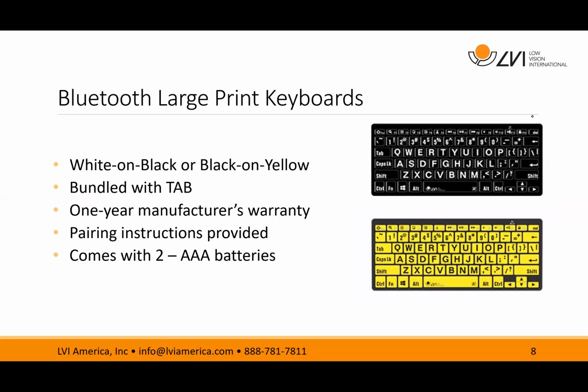We do ship it with a keyboard, so it comes with a white on black keyboard. We do sell these keyboards as well separately. So if you're wanting to get the black on yellow or get any additional keyboards, feel free to reach out to us. We're always your first point of contact, and then we'll put you in contact with the reseller for your area. There's a lot of times people don't know who to reach out to, so feel free to reach out to us and we'll get you pointed in the right direction.